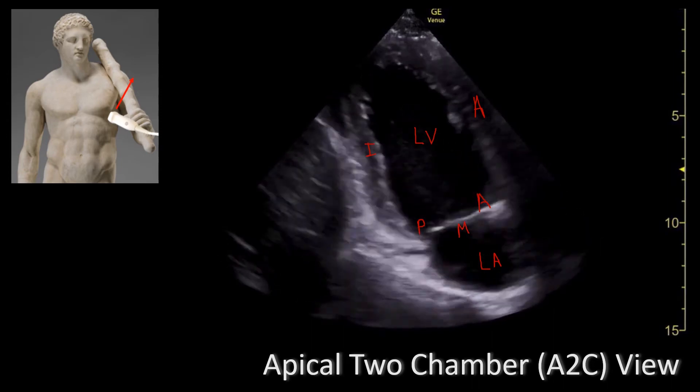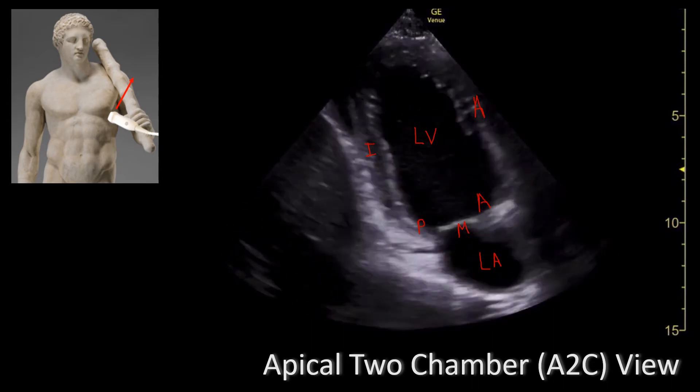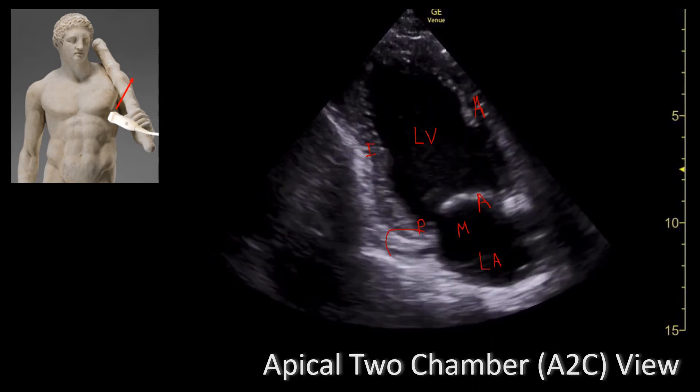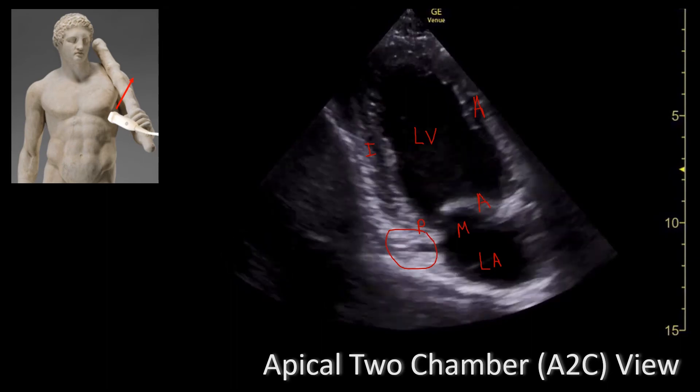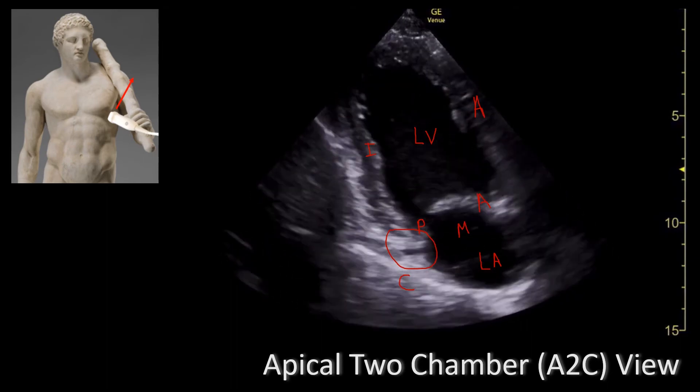If you pay close attention, between the ventricle and the atrium you have this structure right here, and this will be the coronary sinus.